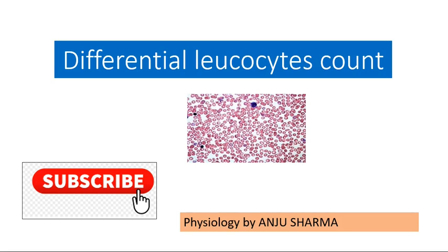Hello everyone. So in this video we'll be talking about what is differential leukocyte count. We have already done the main cautions related to hemocytometer, and we have done TLC, total leukocyte count. Now this is DLC, differential leukocyte count. In this video we'll be talking about how to prepare the smear and how to examine that smear after staining, how to stain that smear, and what that stain is about. In this video we'll be talking about this only.